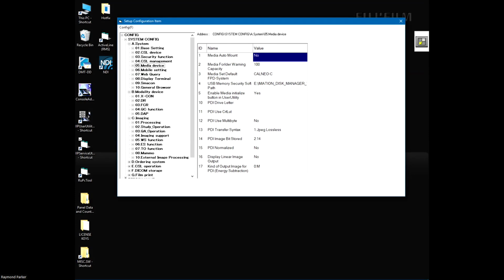There is a PDI license that has to be purchased for you to burn to a CD or burn to a USB stick, but the PDI license provides you with a viewer. We are not talking about the PDI license key. This is a general function that is available at any time for your customers. The only thing that will not be given on that USB stick is a DICOM viewer, which is what you really are paying for with the PDI software.